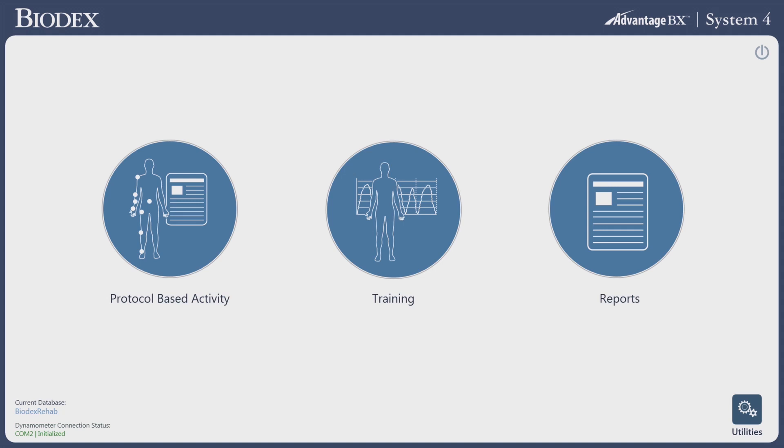We're going to run through the new Biodex Advantage BX software. We're going to go through the training screen — it's a very simple process that should take about 10 clicks to get the device up and running.